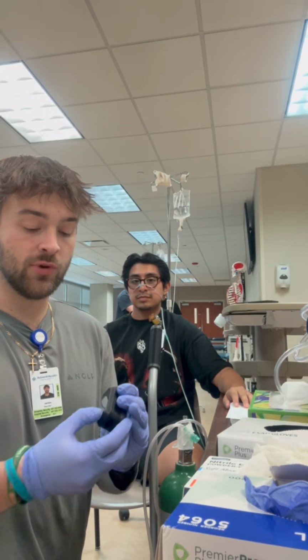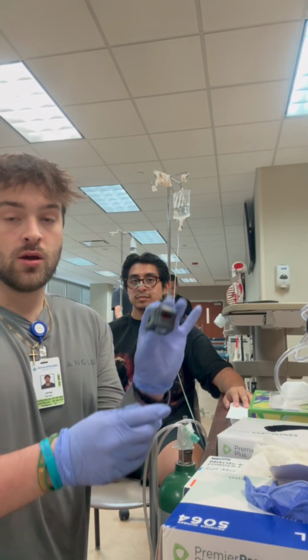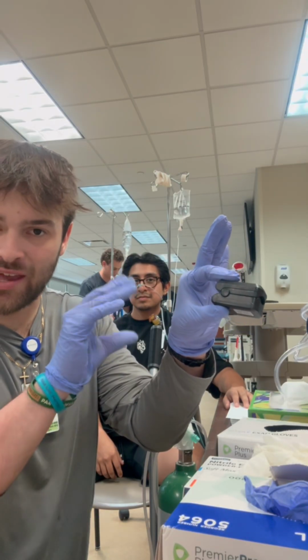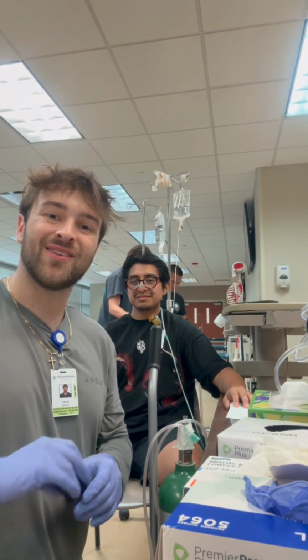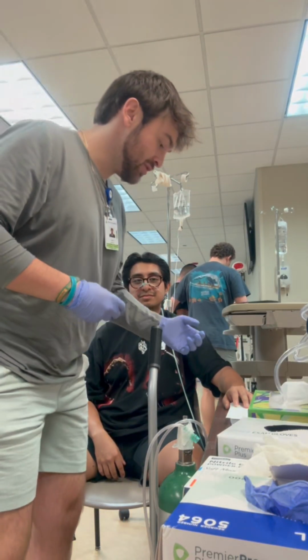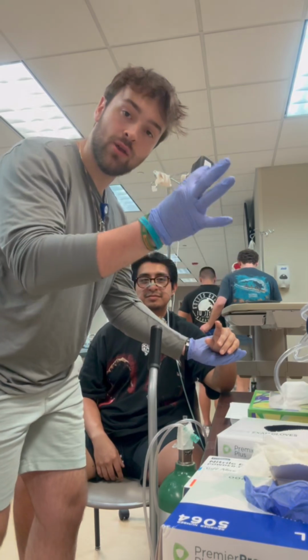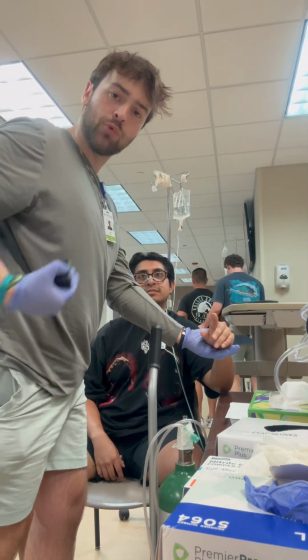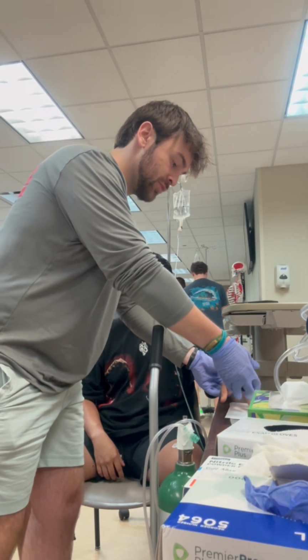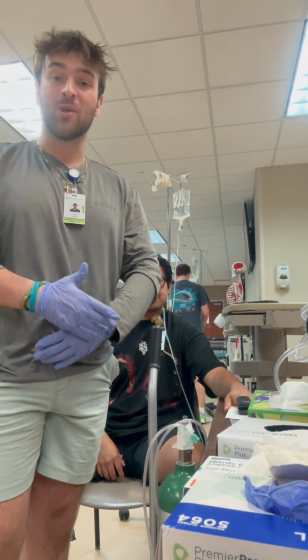So what we're going to do is turn it back on, clench the back of it, pinch it just like this, almost like a gator's mouth, and we're going to put it on the index finger. Johnny, may I see your left hand? Sure can. We're going to go ahead and put it on just like this. Good body mechanics. Put this on just like that and let it rest and see what the reading is going to be.